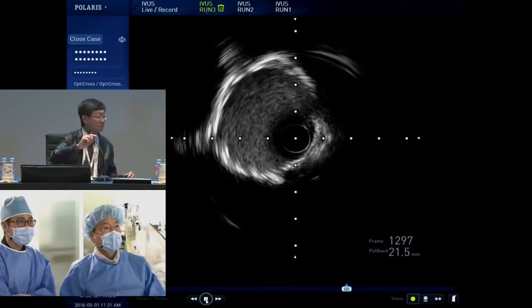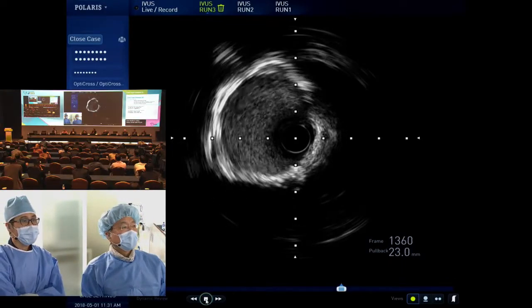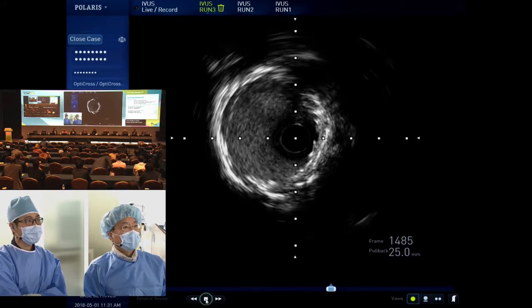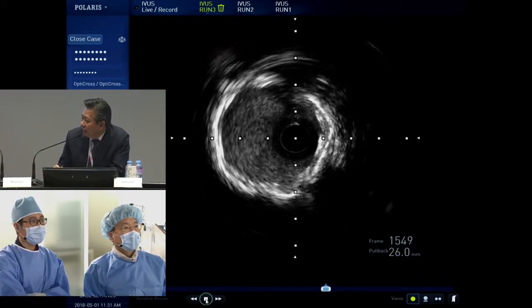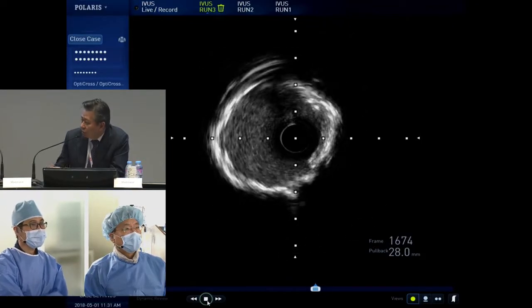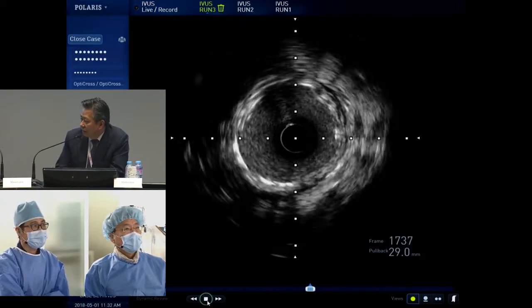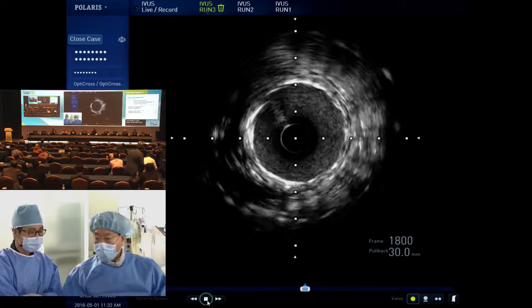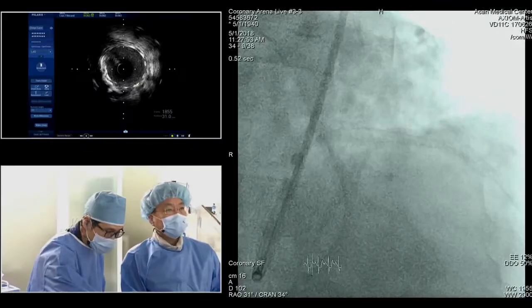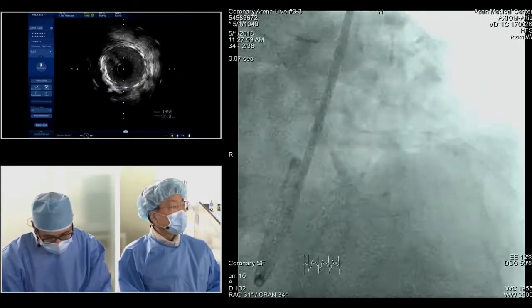Since in this particular case, the narrowest site is not heavily calcified, and the heavily calcified part has enough lumen, I think there's no benefit of routine rotation. But I know in Japan Dr. Saito did start a Japan-US combination. We started to have a trial. So orbital is just in the trial period.